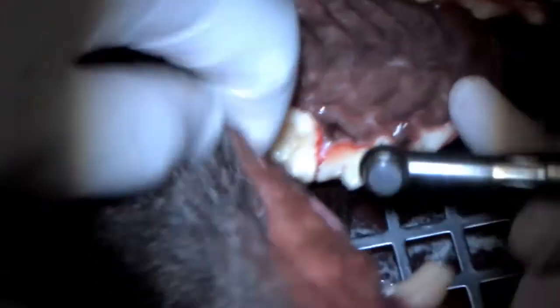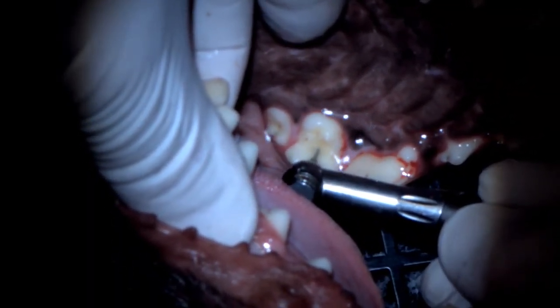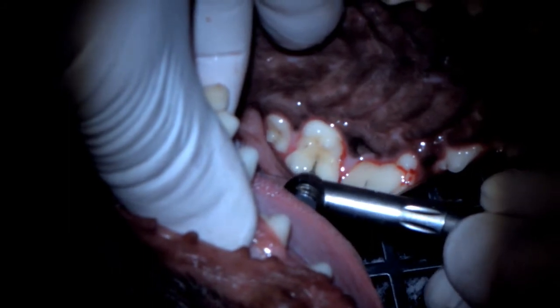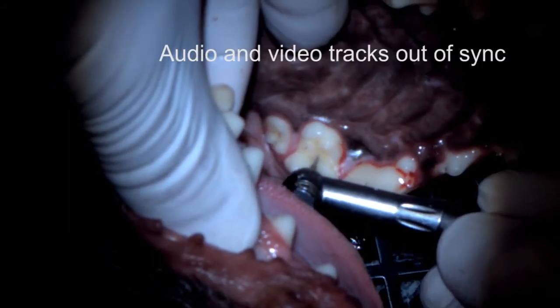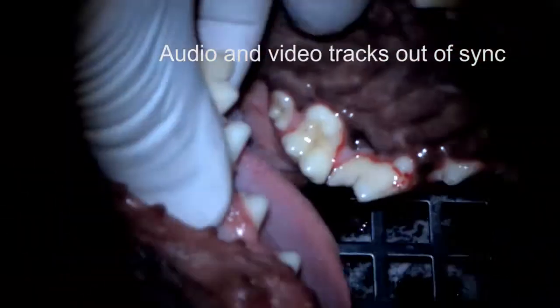If these lesions go deep and get into the endodontic system, then you have to do root canal treatment first, or extract the tooth. There was no sign of that in this case. The goal is to prevent it from getting to that point, and then you fill.